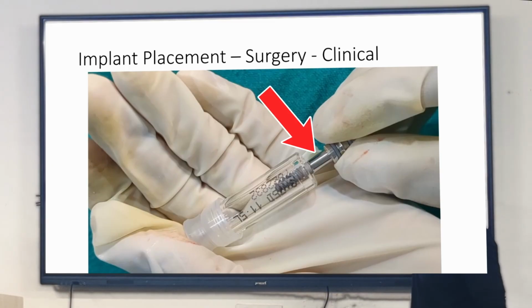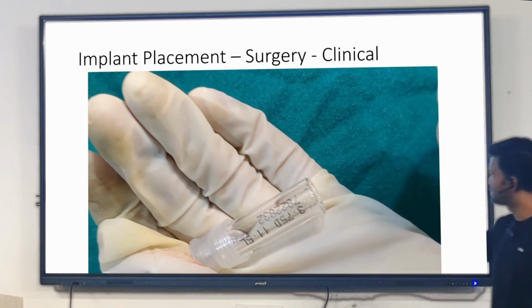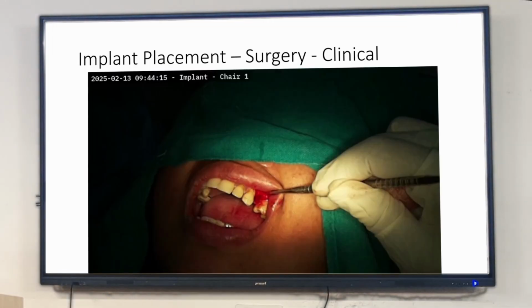Can you see in this implant, the implant driver is attached directly with the implant. It comes already attached. In some it comes, in some it doesn't. Okay. Next. So this implant is now being placed.